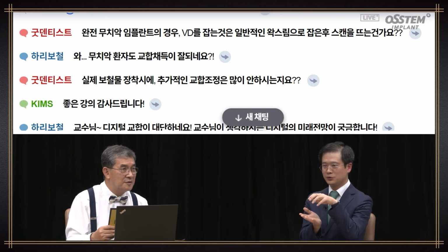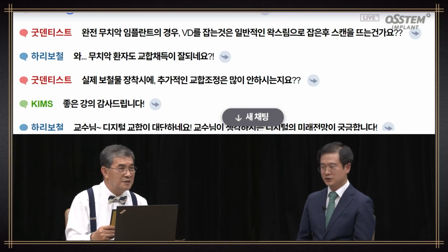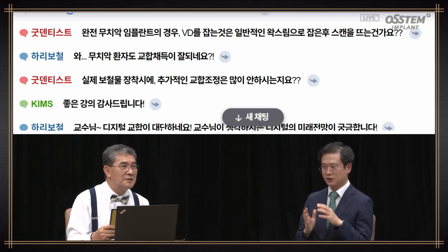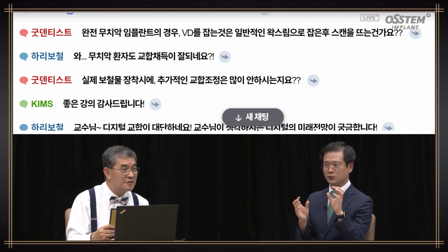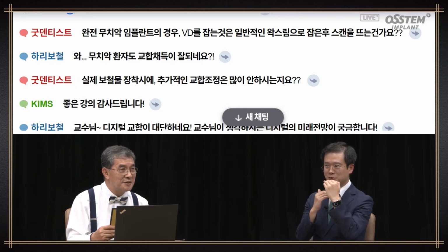If you do it, the patients feel quite nervous, so at times the VD is reflected lower than normal. The patient may put more pressure on it. Centric tray is used to take putty, and the regular body is used to compensate for possible deviations. I put the regular body on top to raise the height slightly, and do it once more to adjust the height and compensate.